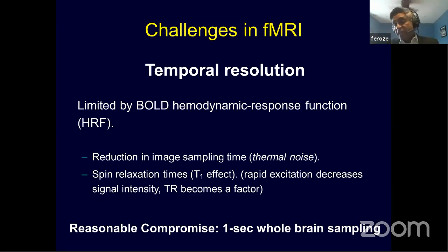However, we have new techniques now that some of you are probably familiar with. It's called simultaneous multi-slice or multi-band imaging, where you could actually reduce the TR and do sub-second imaging. So that's something new that has come around, where you can increase the temporal resolution and collect more data. It may not be that important in doing block design, collecting motor and sensory tasks and language tasks, but it's really important if you're doing resting state to do sub-second measurements.